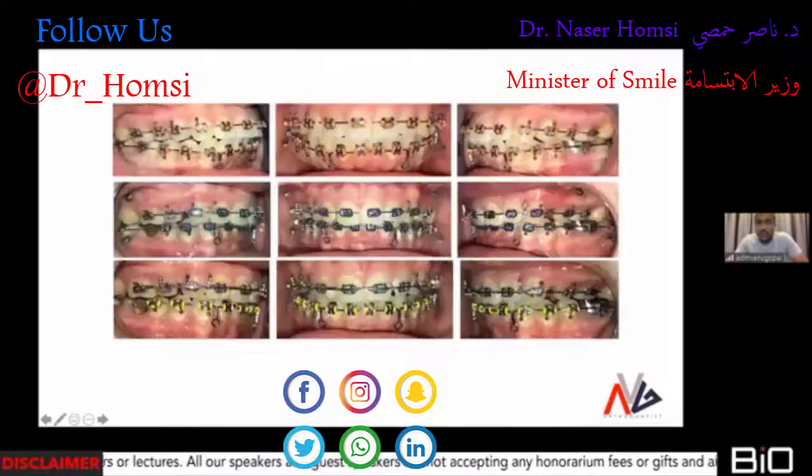Now, as you can see, the brackets are conventional brackets. These are just the regular MBT brackets. Now, as you would have seen on other channels or other papers, most of these procedures are done on self-ligation brackets because of the low force and all those claims. But yeah, what I'm trying to say is that conventional or self-ligation doesn't really matter. You could use the same mechanics on any bracket and you could get the same kind of results.